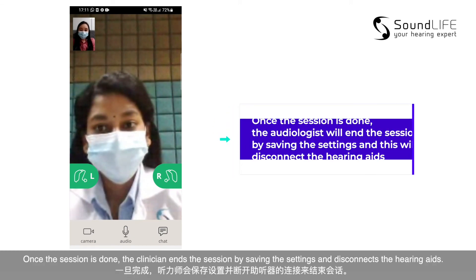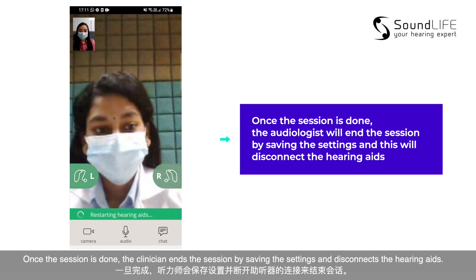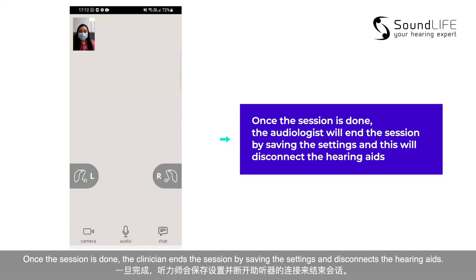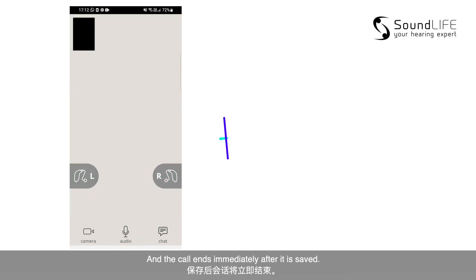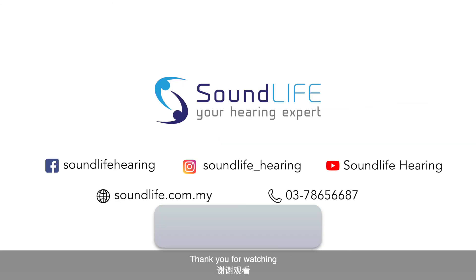Once the session is done, the clinician ends the session by saving the settings and disconnects the hearing aids, and the call ends immediately after it is saved.